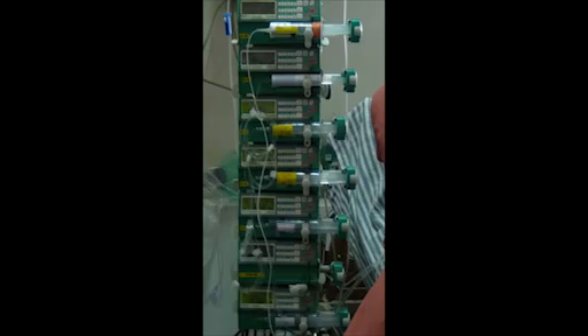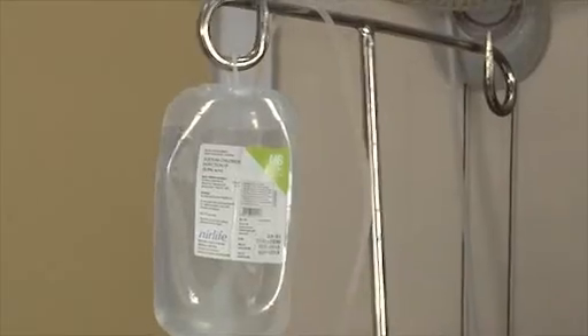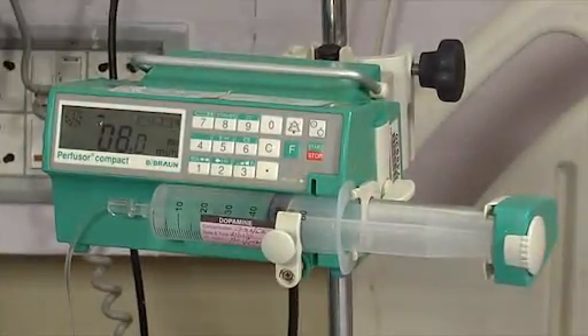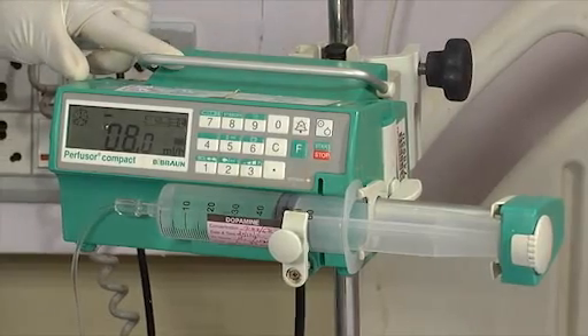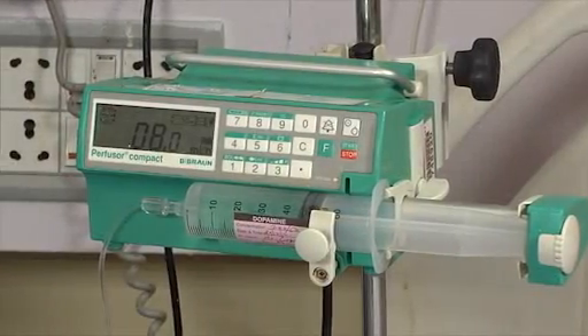Sometimes syringe pumps are also clamped onto stands. If this is done, make sure the clamp is tight and secure and the stand doesn't have any IV drip hung over it as well. If the IV fluid leaks, it may damage the syringe pump and also be a fire hazard.